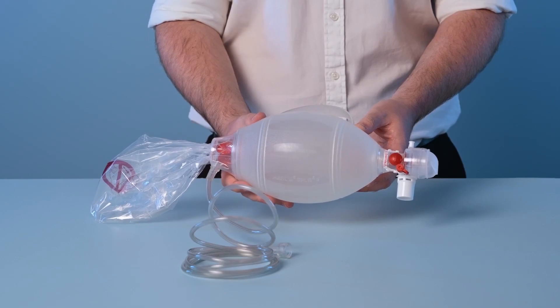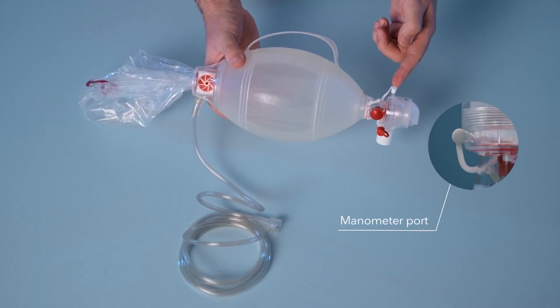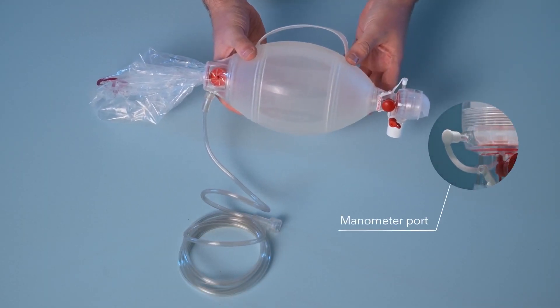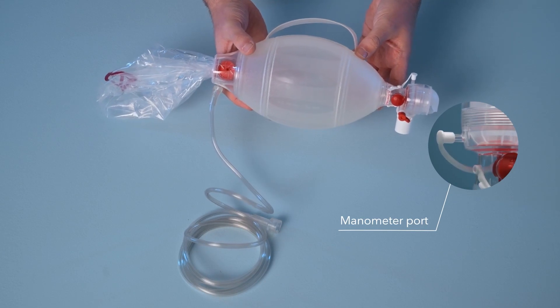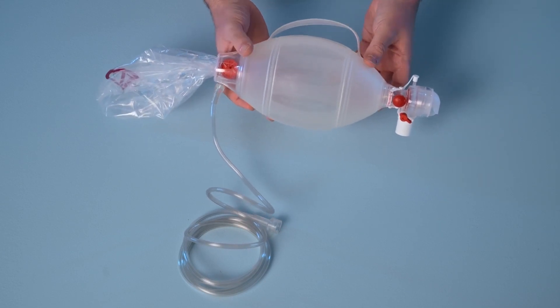Located above the patient connector is the manometer port, and this allows for the Ambu disposable pressure manometer to be connected to the Spur2 for the purposes of pressure monitoring.